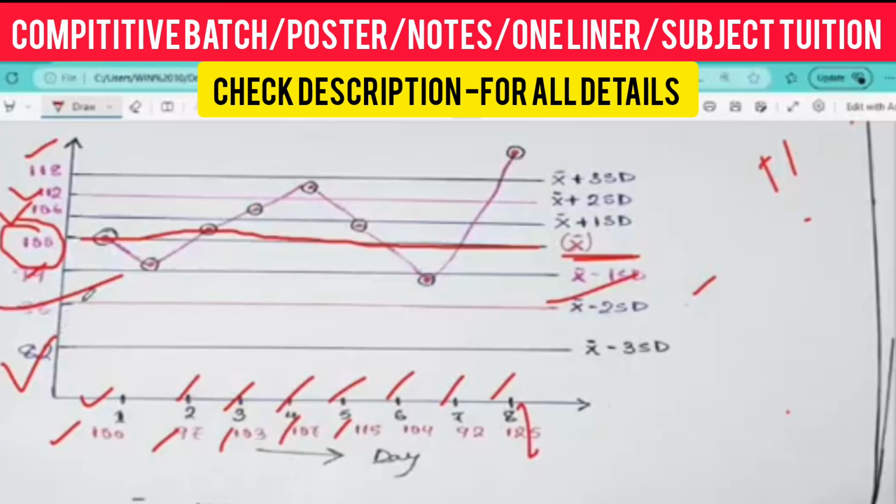Now I am doing the graphical representation. The first day was 100, within the 100, right? And on the second day, see, I am just present here. Second day within 94. Yes or no? Second day within 94. Third day within 107, that is 103. See, 100 and 106. So if the result is 103, it is put here. Are you understanding the graph? Yes, sir. Okay.